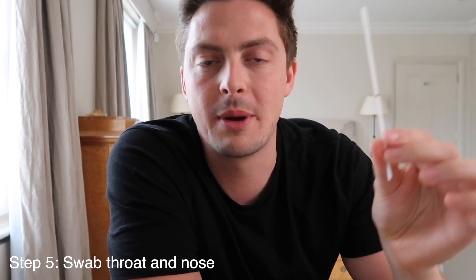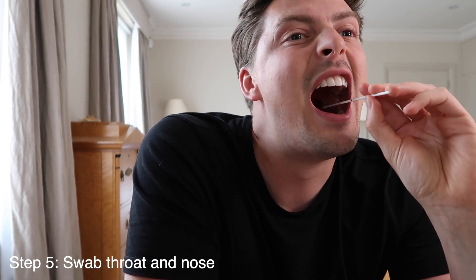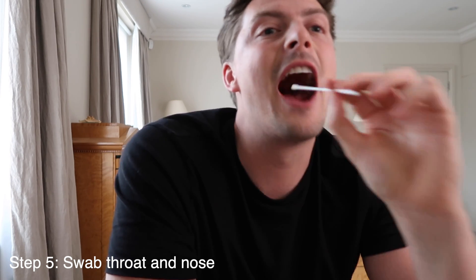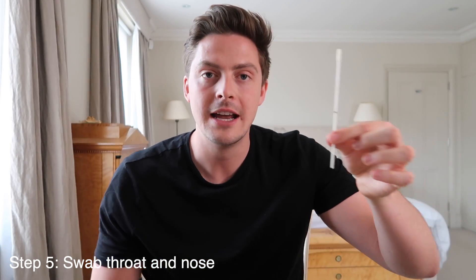I'm going to try and do this without gagging. I'll look in the mirror to do the throat swab — you won't be able to see but you'll have to trust me. Done. Keep your mouth wide coming out and be very careful not to let the swab touch anything on either side, because now it's going straight up your nose.